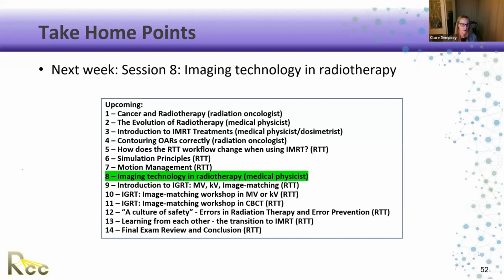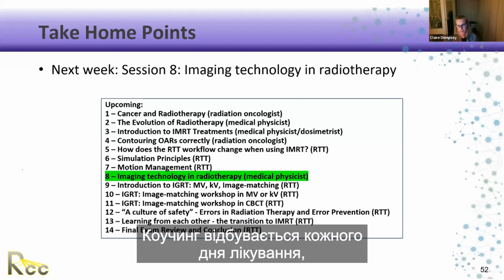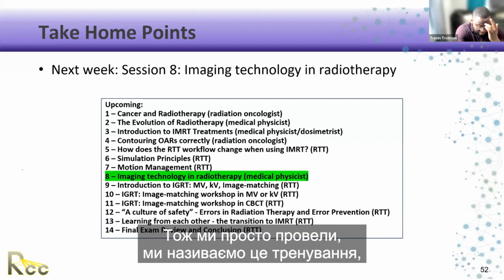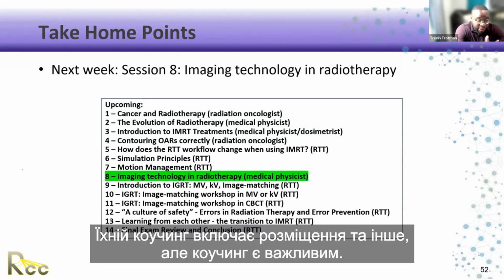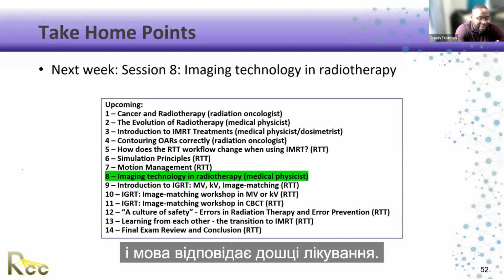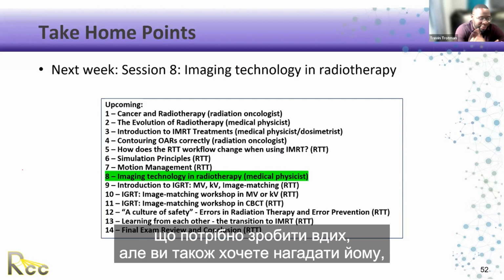Just one more quick question: does the coaching happen every day of treatment, or is it something that you do at simulation and then? So we just had what we called a re-education, where we established guidelines for the RTTs for their coaching, block placement, and everything. But coaching, which is a big one, we went over the language, how the patient should be taught, and that should be done every single day. We coach the patient every day from simulation, and the language is consistent to the treatment floor.